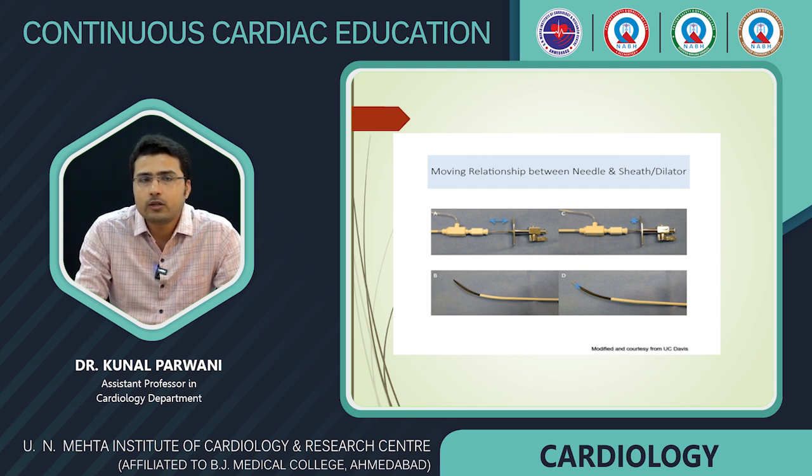If the needle is connected to the pressure transducer, when the puncture is made, there is a sudden elevation of the pressure as the needle passes into the left atrium. Once the left atrial entry via the fossa ovalis is confirmed, advance the sheath and dilator assembly over the needle. It is advised to keep the needle at the fixed position.